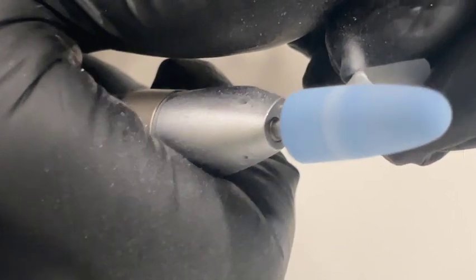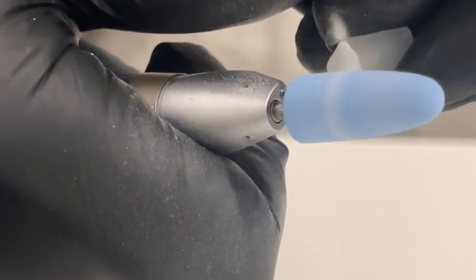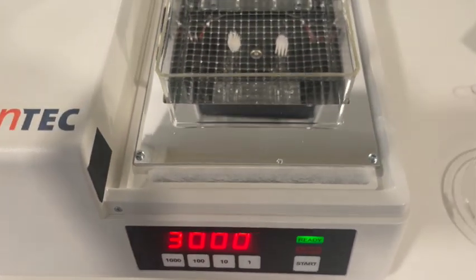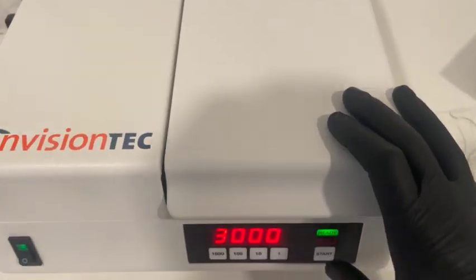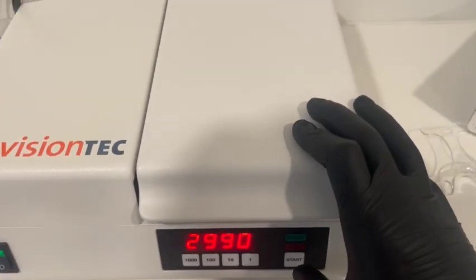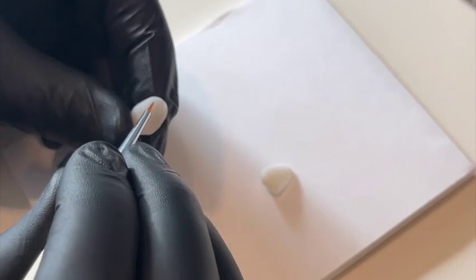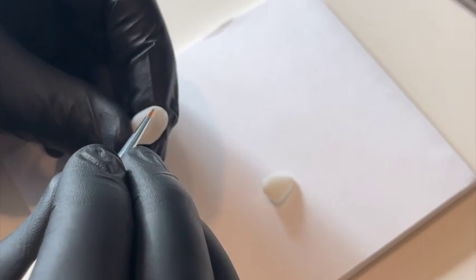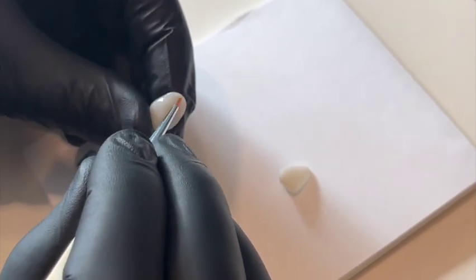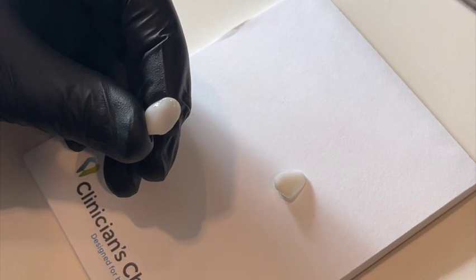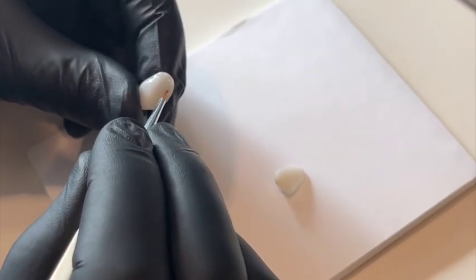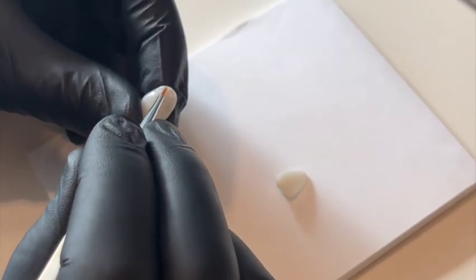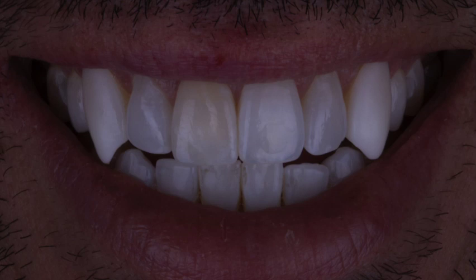And then I like this burr. It's just a little kind of a mushroom, medium grit mushroom to remove those support points that are remaining. We'll put it in our Otoflash to cure. Do a little staining and glazing on one set. Here I am using VC's OptiGlaze. And then once that is ready, back in the Otoflash for 3,000 flashes. And this is what we get.